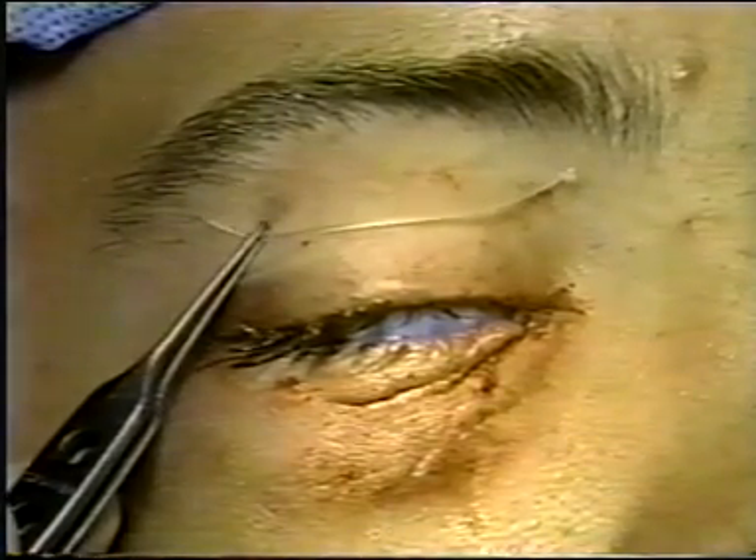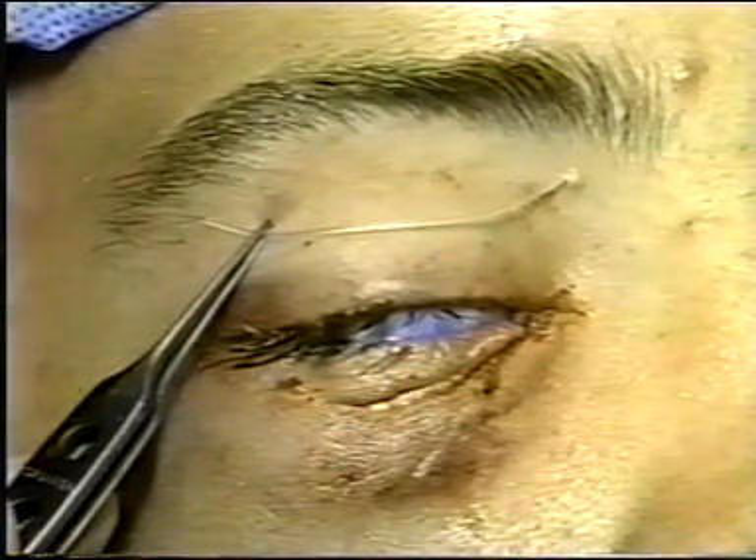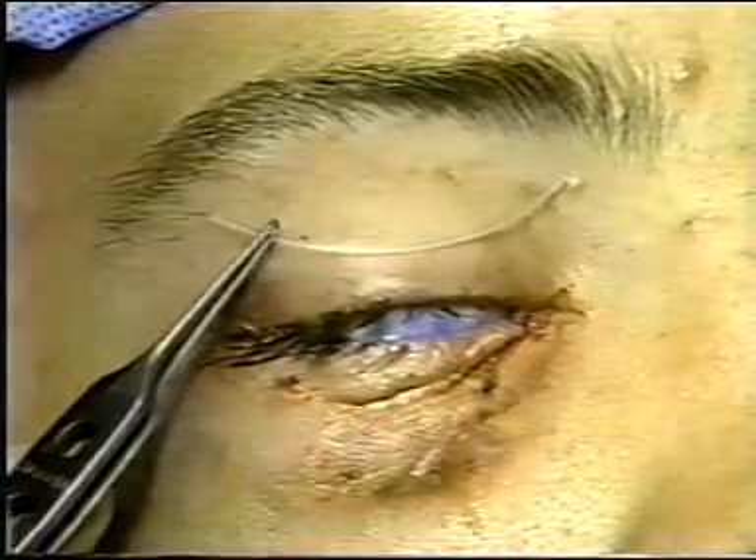Here we can see the silicone Mini Monoca as it comes out of the box. We feel that cutting the tip allows for easier insertion into the canaliculus during the surgery.